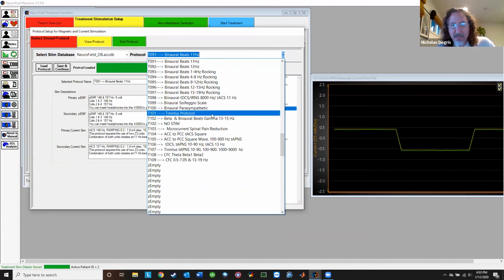This guy is to be used at T3, T4, T5, T6. And then also headphones with an analog volume control plugged into the front of the Z3, designed to help reduce tinnitus that's produced from a traumatic brain injury, not from a viral infection. It has to be the type of tinnitus that is very, very high frequency, high pitch, and the person has to have a history of the tinnitus beginning after a traumatic brain injury.